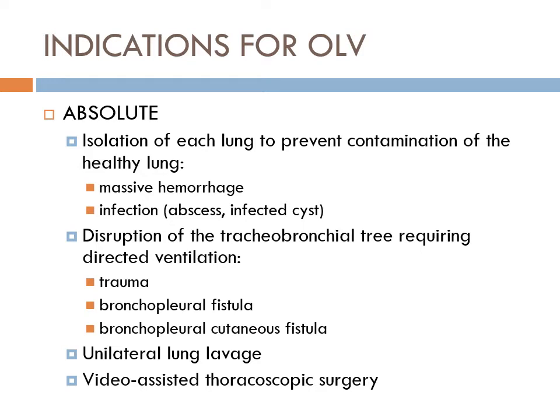So at the same time, what you're now listening for is how much pressure to add to the cuff. What you would do is turn the APL valve to about 20 centimeters and hold the bag at about 20, because you slightly close the APL to 20, but you're really looking at the little dial that tells you what your pressures are. So 10, 20, 30. You want to inflate your bag by closing the pop-off and having enough flows to get that needle to about 20. And at 20 is when you should hear your cuff leak go away. So you inflate enough air so that at 20, the cuff leak that you're hearing with your stethoscope is gone.